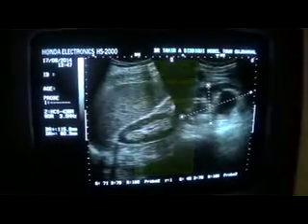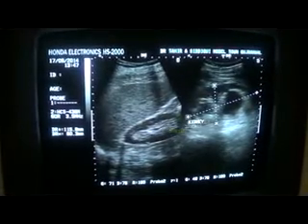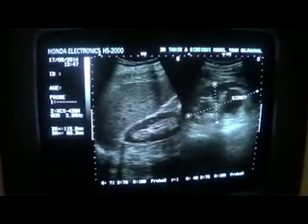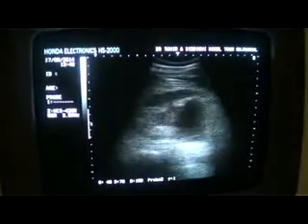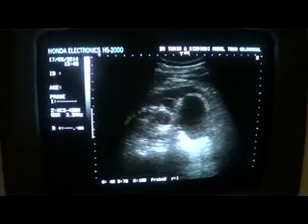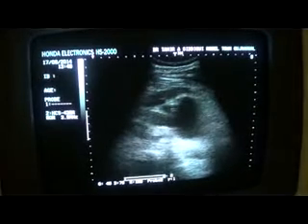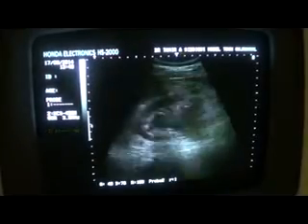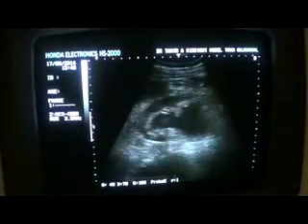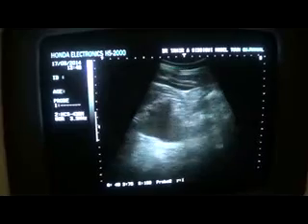and this is the left kidney. This is the right kidney. So we see dilated calyces, dilation of all the calyces, and not only that, we see that the corticomedullary differentiation is intact. This is the cortex and parenchyma, in other words, and this is the pyramid. You can see this is the cortex. So corticomedullary differentiation is intact. There is no focal lesion seen relating to it, and there is no calculus seen in either lower or upper pole of this kidney.